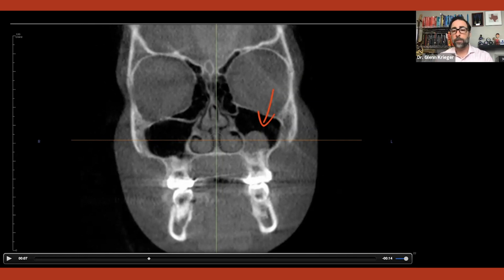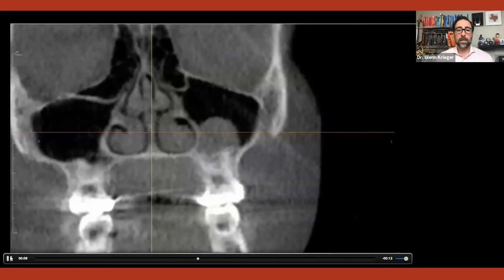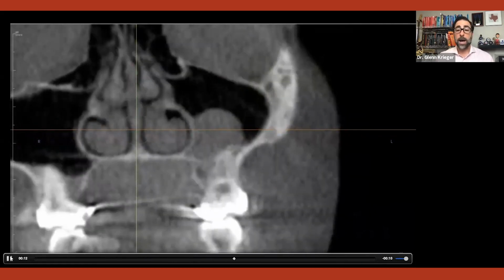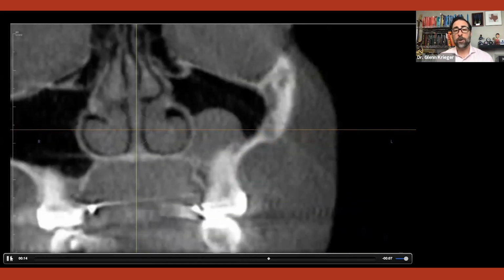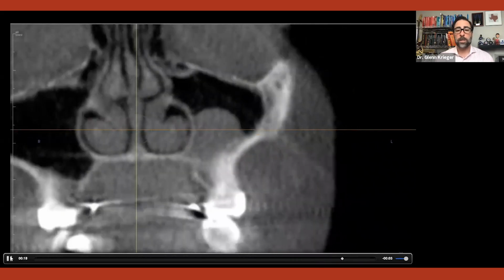Now, you might say, well, I've broken the law, or it's not documented any other way, but everything in my office is on video and audio. And they say, sure, no problem. And they're scared about somebody stealing this. So I send this to the ENT, and by the time the exam's over, typically my ENT, if they're not in surgery, will say, don't worry about it. And I'm actually saving them a visit. So again, you're going to find some curious stuff from time to time, but you look in the sinuses, that's not normal. You spot that a mile away, and that's the kind of stuff you're going to see when you do a systematic view or exam of your CBCTs.